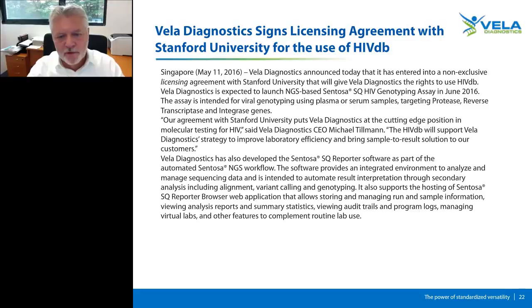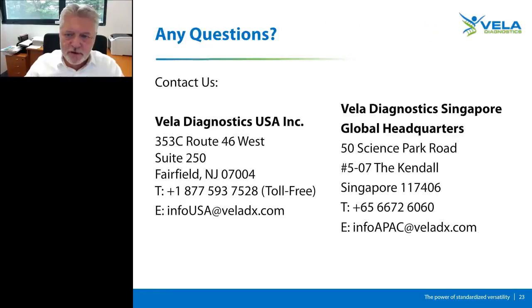However, as I mentioned before, due to the export of the FASTA file, the user can also BLAST their data against other databases, like the Rega database in Europe, the French database, or the Phenotigeno database. With this, thank you for your attention, and I'd be happy to take questions.